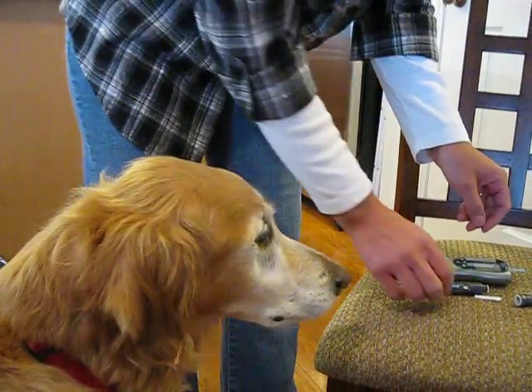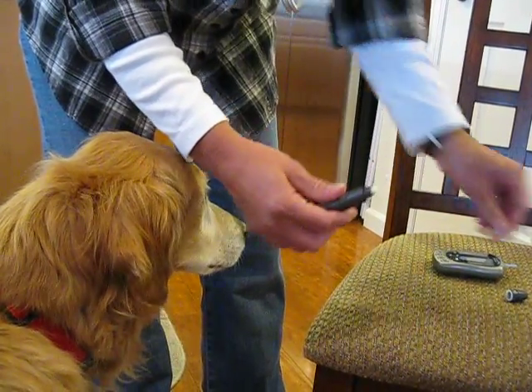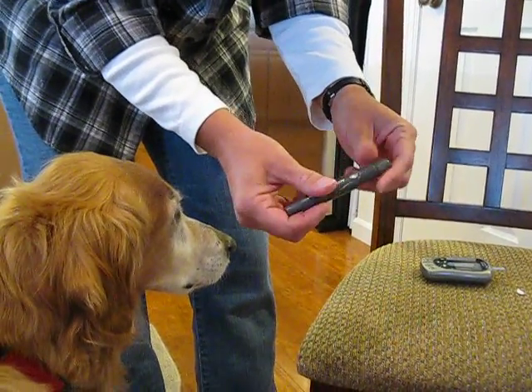We're going to test Allie's blood sugar. I have the AccuTech SoftClicks, which I like to use. I put the lancet in, twist the cap off, and put the lid on it. I use 2.5 for the setting on her. Push the button on the end so it's ready.